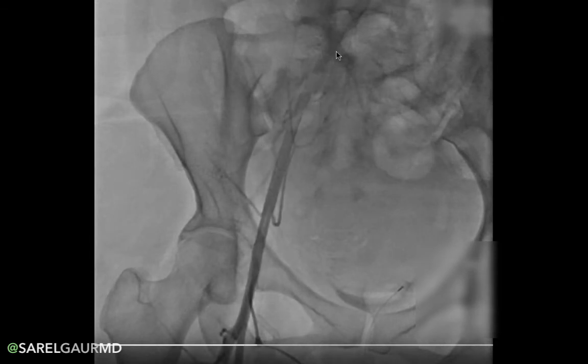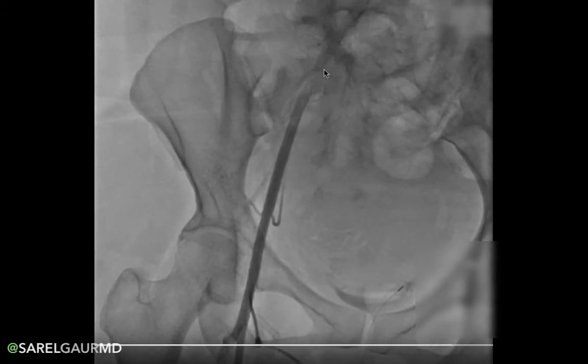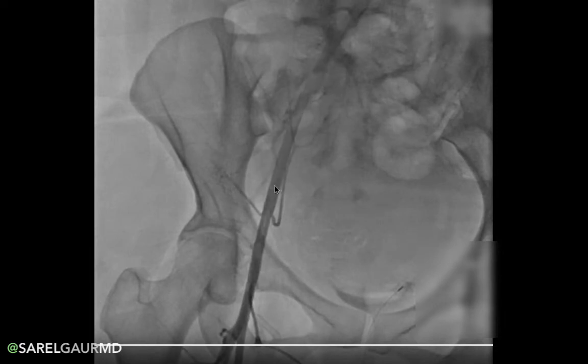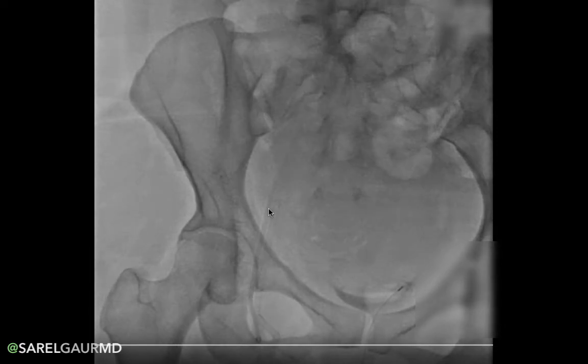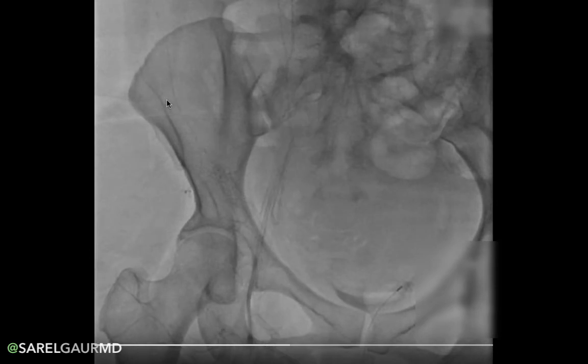You can see it coursing out this way. As the internal iliac artery comes off, this artery becomes the external iliac artery. This runs deep inside the pelvis. As we trace it down, we see two branches: one coming out laterally, which is the deep iliac circumflex artery — the DIC. You can see it taking the curve of the iliac bone there.